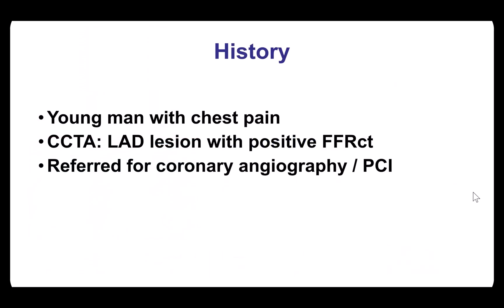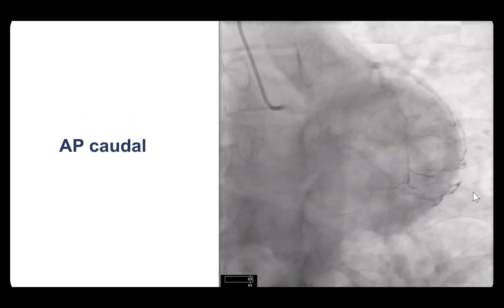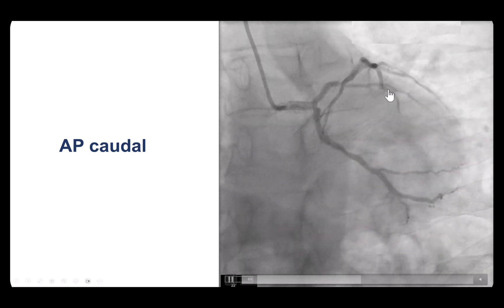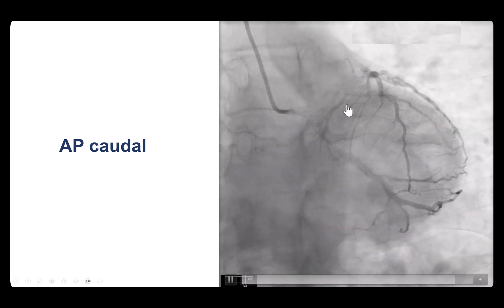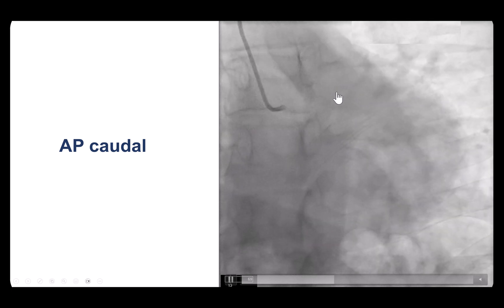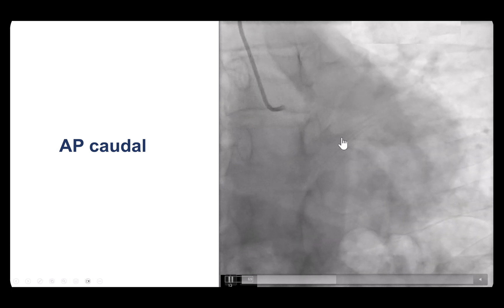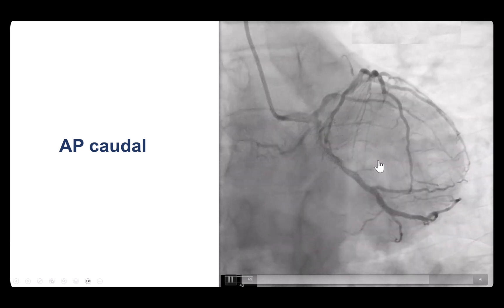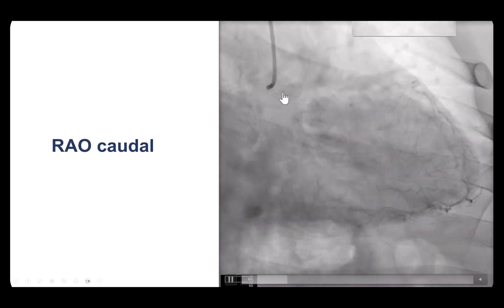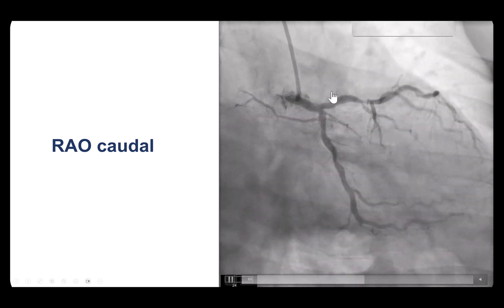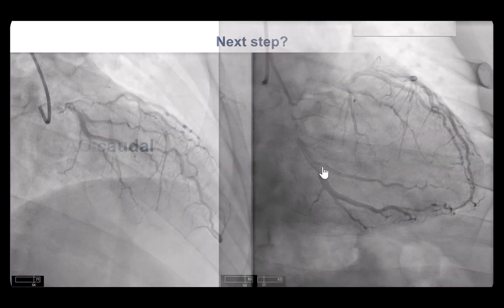This was a young gentleman who presented with angina. He was found to have an LAD lesion on coronary CT angiography with positive FFRCT, and he was sent for coronary angiography and possible PCI.